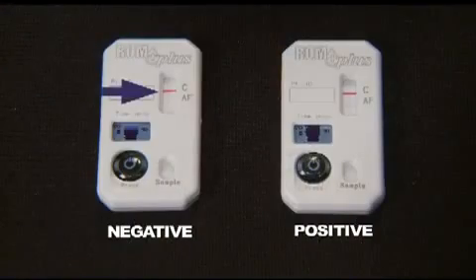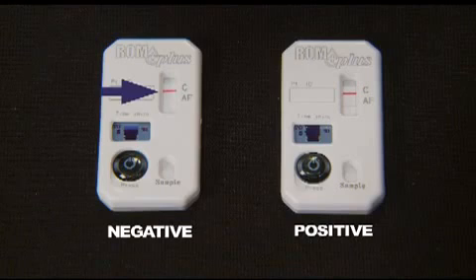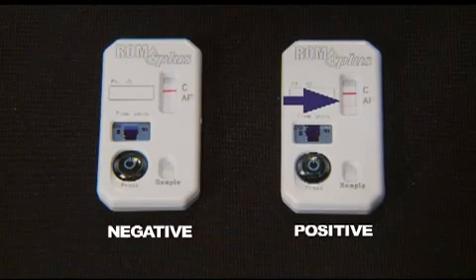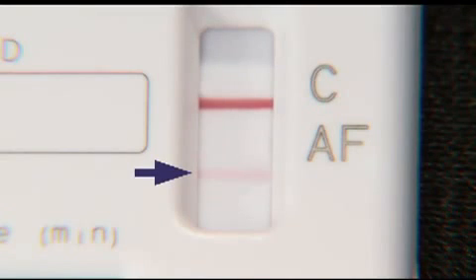Read the test result from five to twenty minutes. Only a control line should be visible for the negative control. Both the control line and the test line should be visible for the positive control. The test is positive even if the stripes are faint.